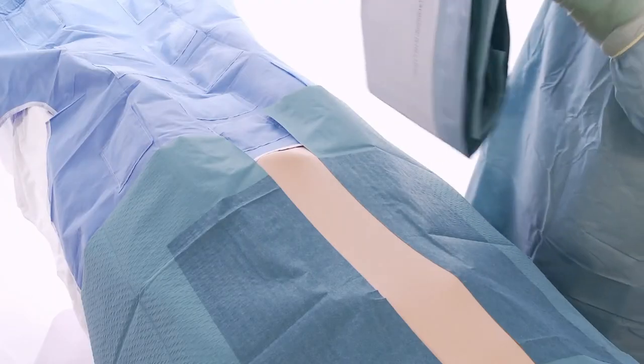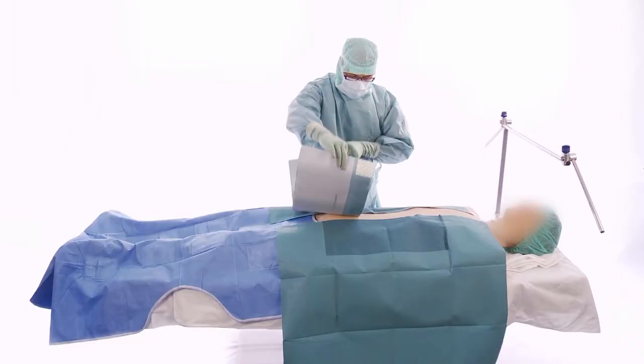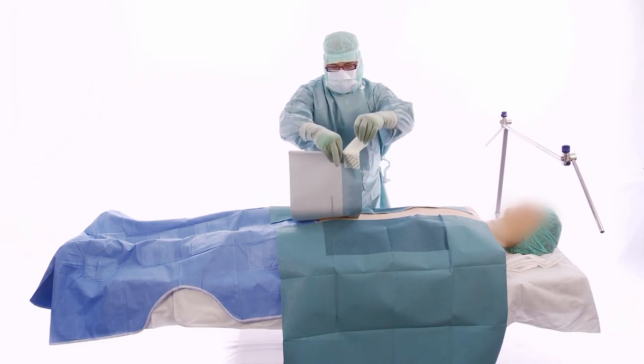Place your hand inside the folding and place it on the patient. Partly unfold the OP sheet and remove the second and third release papers.